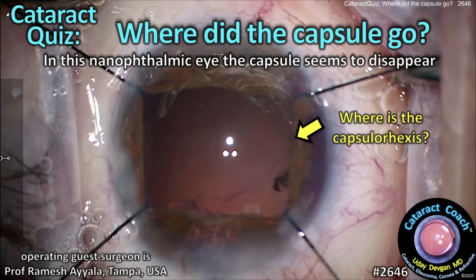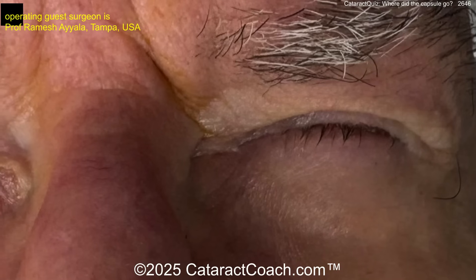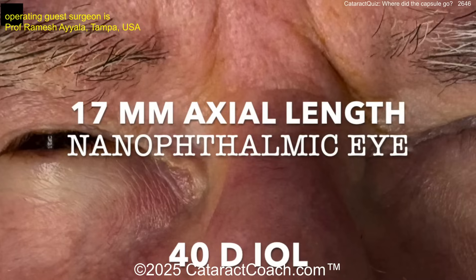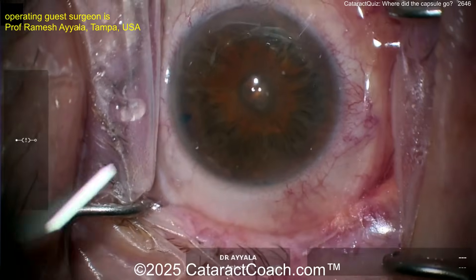Cataractcoach.com cataract quiz: where did the capsule go in this nanophthalmic eye? The capsule just seems to disappear — this is a tough eye. Where is the capsular back? Very tiny, sunken-in eyes, very short axial length of 17 millimeters — definitely nanophthalmic. That's stressful — a 40 diopter lens.